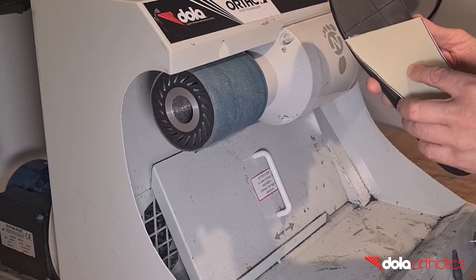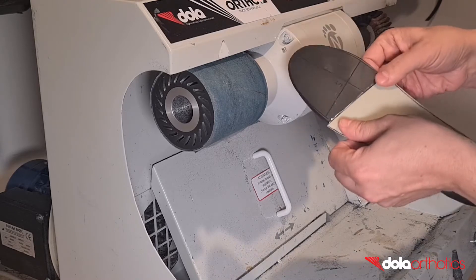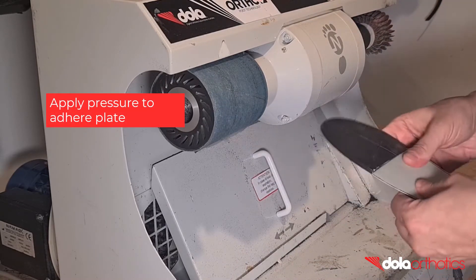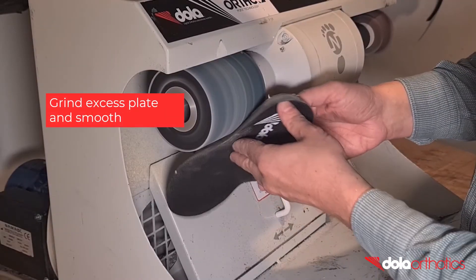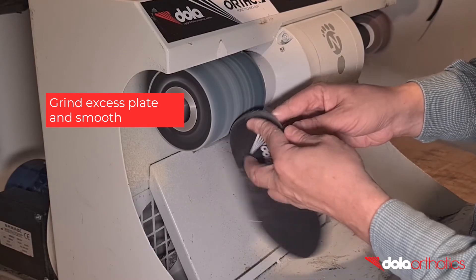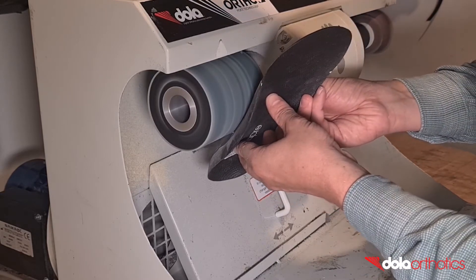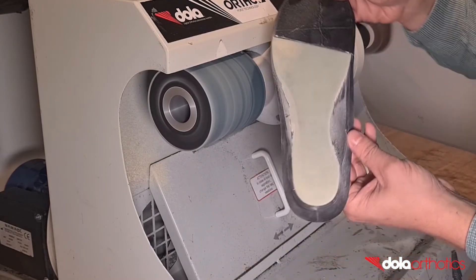Once dry, align the Dollar Tech plate with the markings and adhere the two surfaces together. Apply pressure over the entire surface to ensure adhesion. Once dry, complete a finishing grind of the lateral, posterior and medial borders and taper to follow the planar surface. Grind small sections at a time until you become comfortable and finish with a continuous grind for a smooth finish, or use sandpaper.